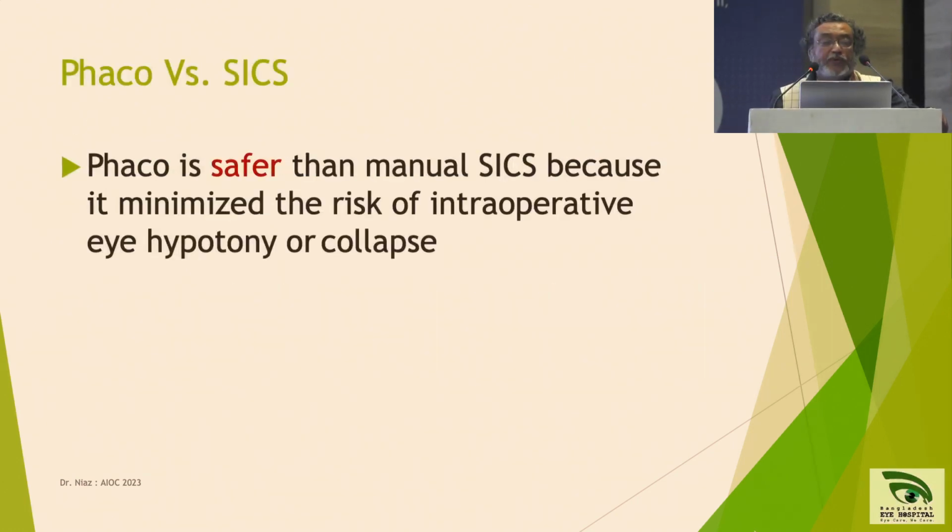Now, to start off with, I'd like to just reiterate phaco versus SICS. In these eyes where vitrectomy has been done, there's no vitreous in the posterior chamber, it's only fluid. It's the aqueous, actually, which fills up the posterior chamber. And if someone wants to do an SICS, it is often that when delivering the nucleus, you have to apply a little bit of pressure in the eye.